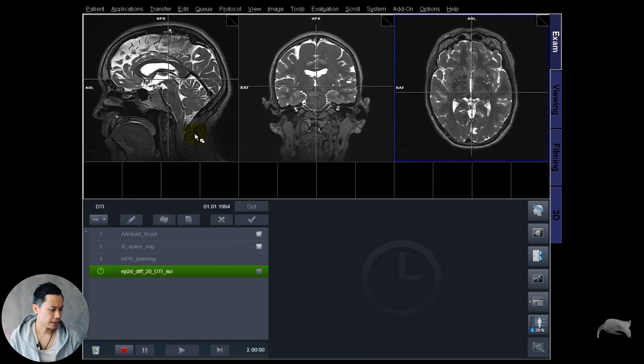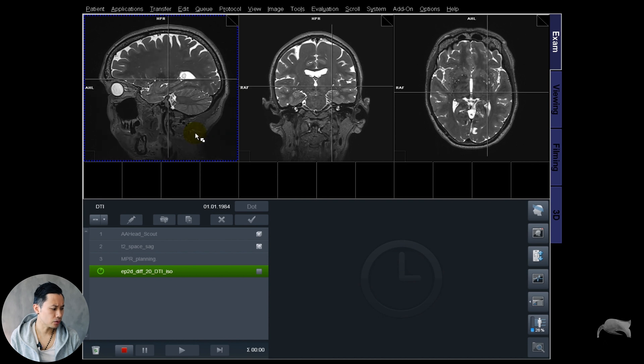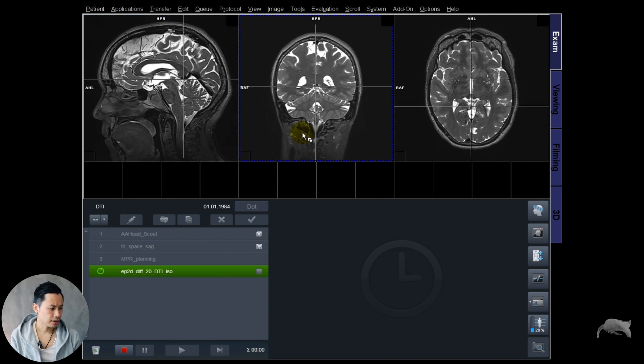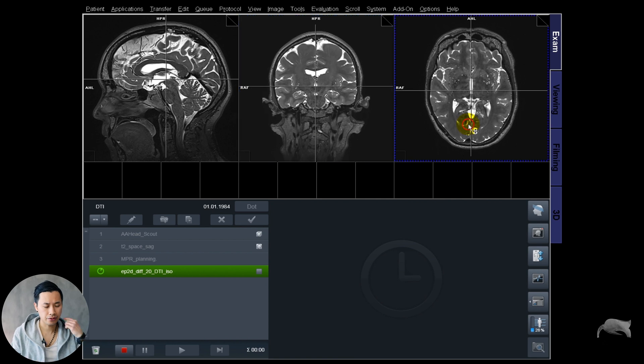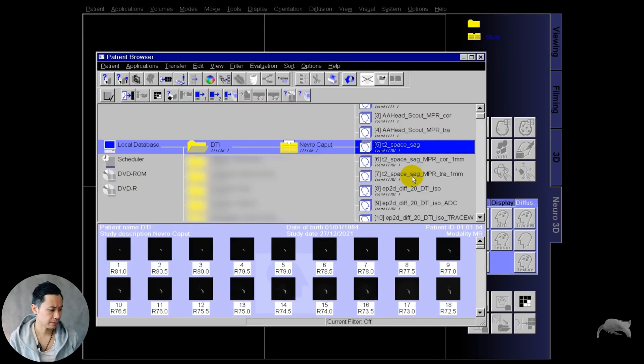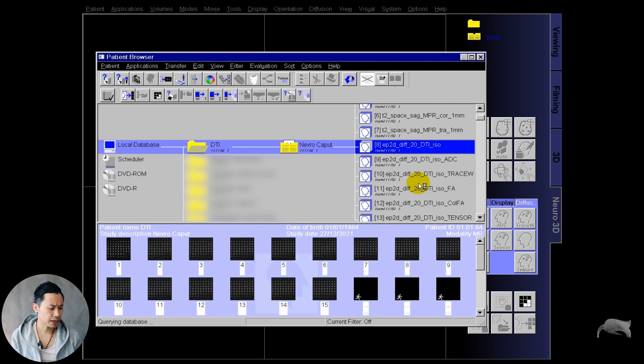Let's run that sequence. This is the T2 3D I already scanned. I'm going to use this as a reference when doing the post-processing. The sequence is done now.